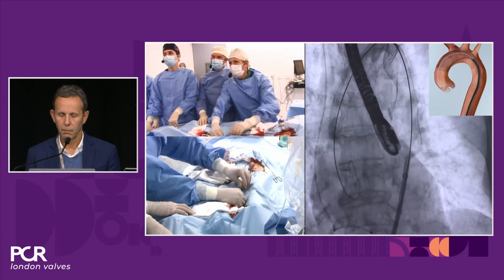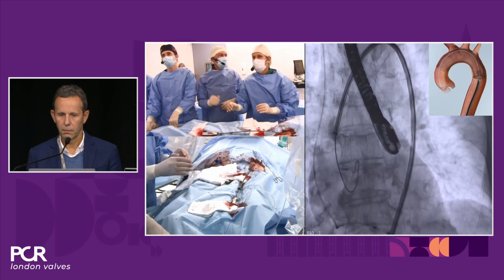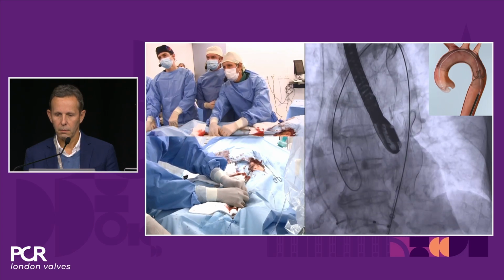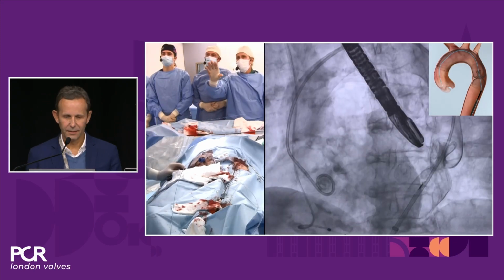Until we see the port, and we form the port like this. That's where the debris is going to be captured, right? And then we finish deploying the whole filter. Perfect. Good position, right? So now the Emboliner is deployed.